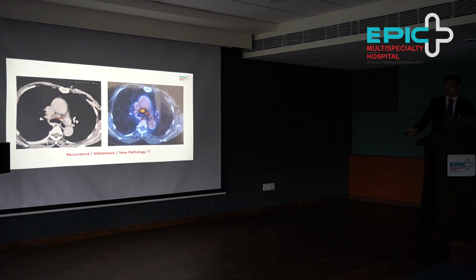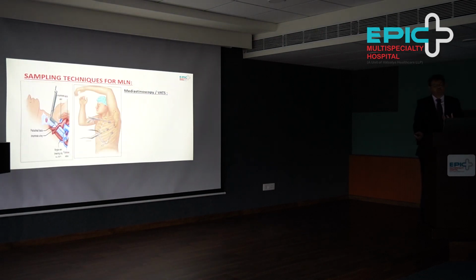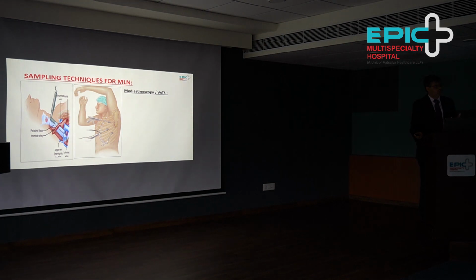Now the patient is asymptomatic, but we need to identify certain questions: whether this is recurrence of a NET, whether it is metastasis, or whether it is new pathology. And for that, we need to have sampling. So what are the conventional options till now, before EBUS?